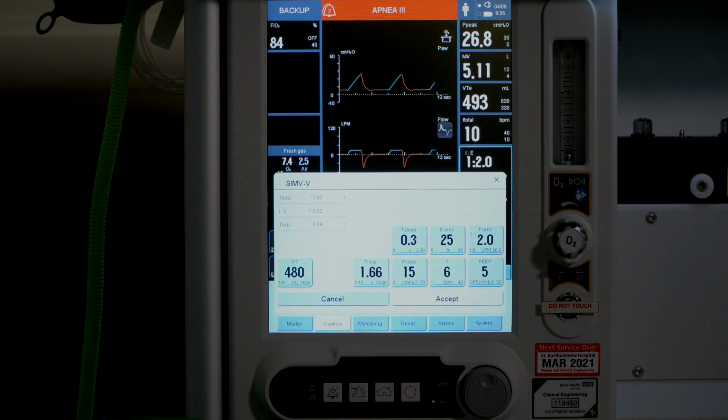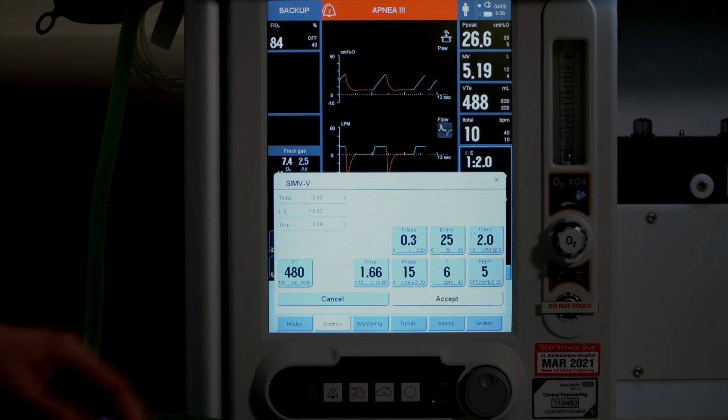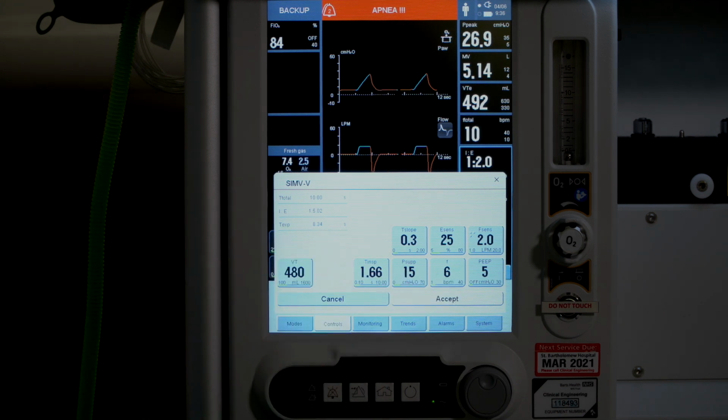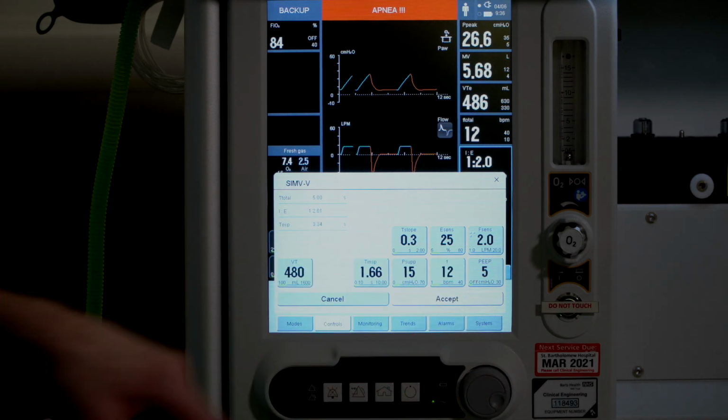Looking at the SIMV modes, again, these are pretty similar to SIMV as we would consider it upstairs, but there are a number of small differences that are quite significant. So firstly, if you look at volume control, pressure control or PRVC, if you're just thinking about the SIMV part, it defaults to a respiratory rate of 6, which is too low for the majority of our patients, so we recommend that's turned up to 12.